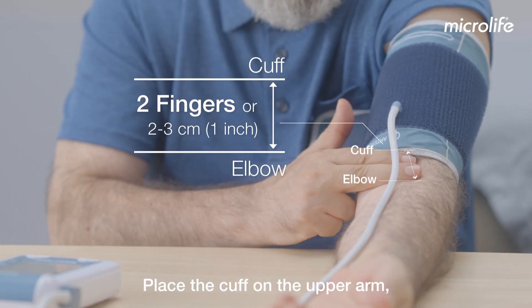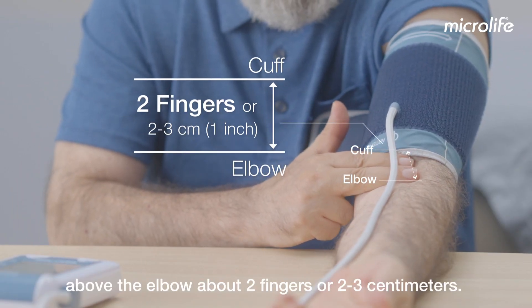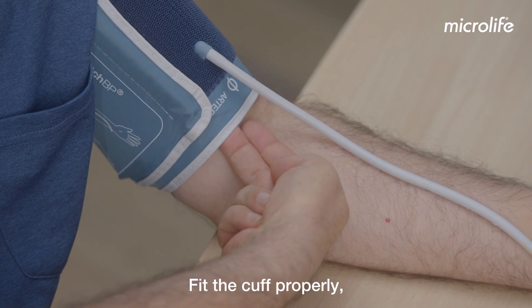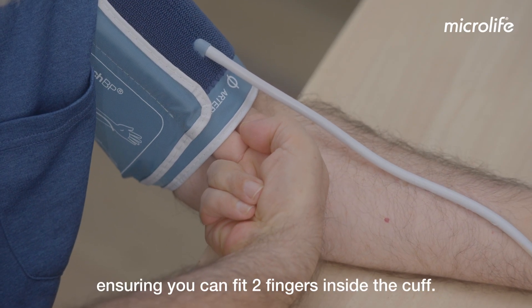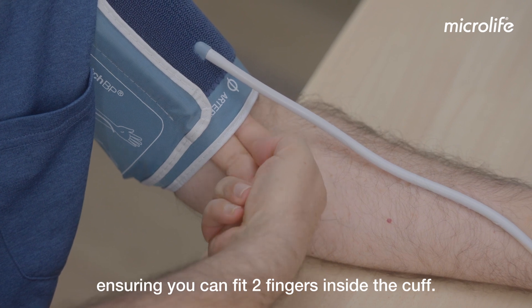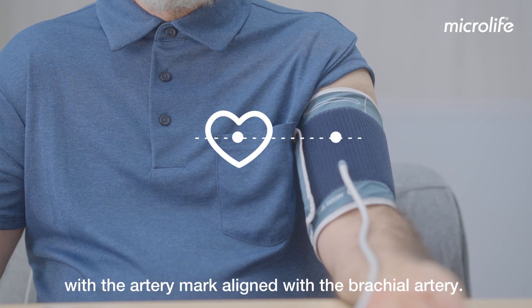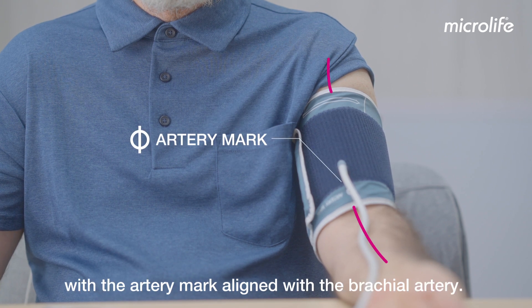Place the cuff on the upper arm above the elbow about two fingers or two to three centimeters. Fit the cuff properly, ensuring you can fit two fingers inside the cuff. The cuff should be at heart level with the artery mark aligned with the brachial artery.